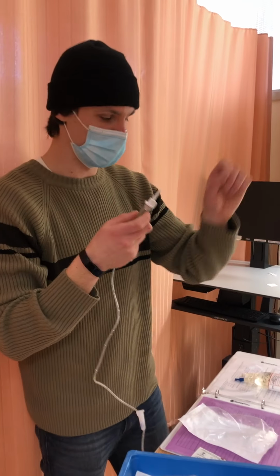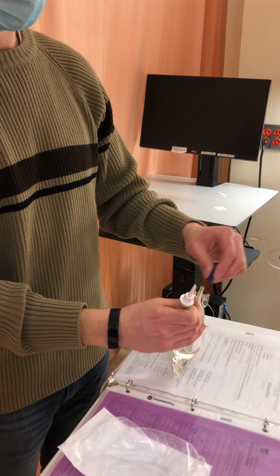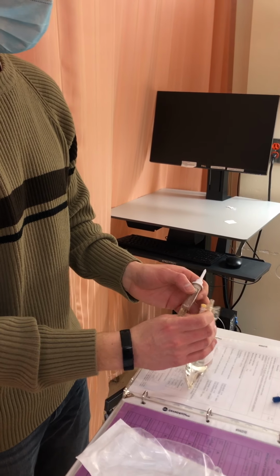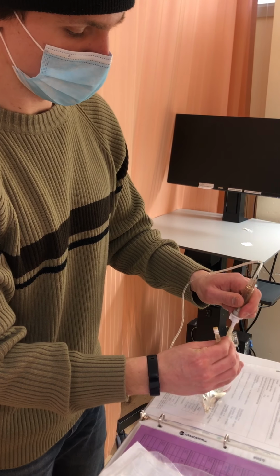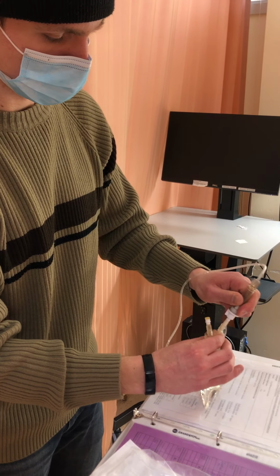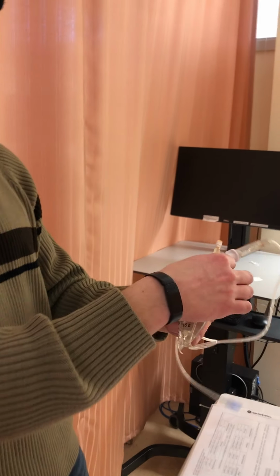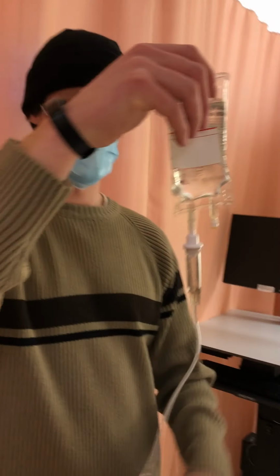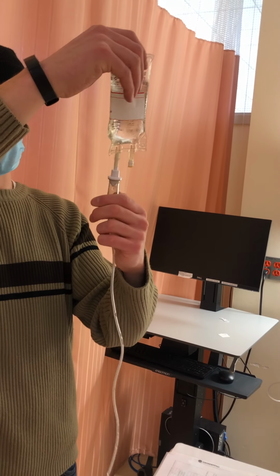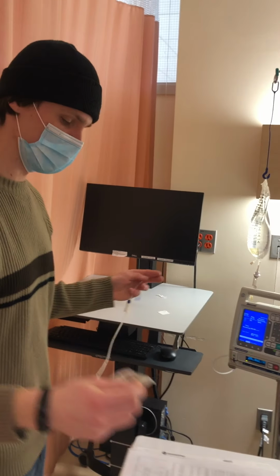So I take the cap off, maintaining sterility. Put this upside down here, and just spear the bag here. Perfect. And make sure that the roller clamp is closed here, and just prime the chamber a little bit.